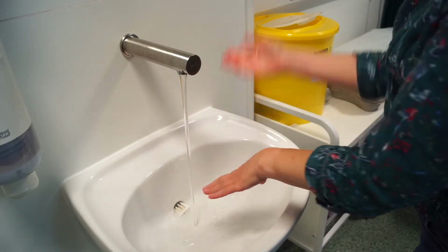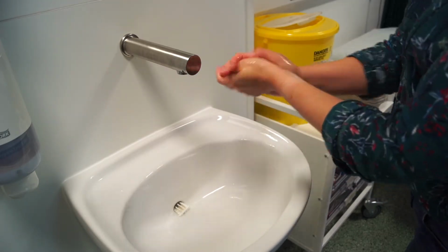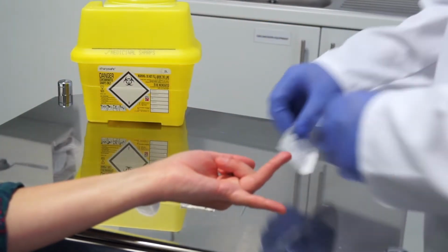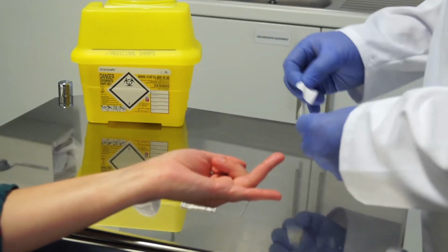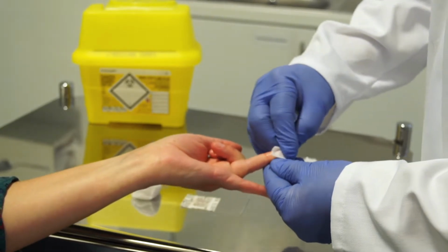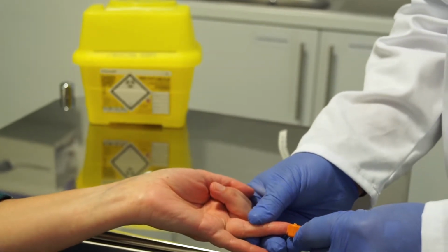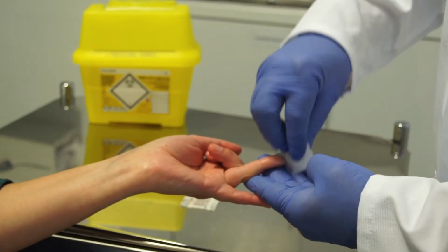Instruct the patient to wash their hands in warm, soapy water. Then sit them down and choose the middle or ring finger on their non-dominant hand to provide the sample. Clean the selected fingertip with an alcohol wipe and allow it to air dry. Place the lancet off-center on the fingertip. Press the lancet firmly against the finger and puncture the skin.